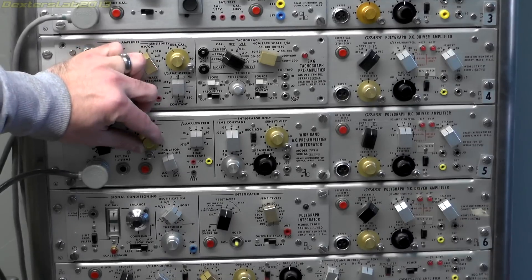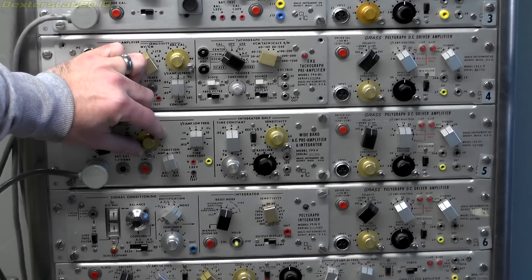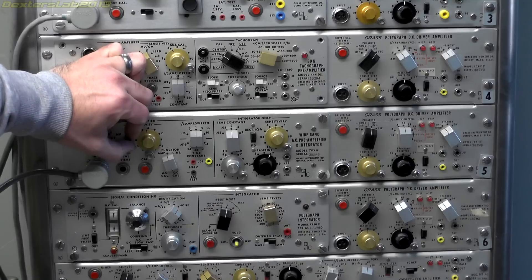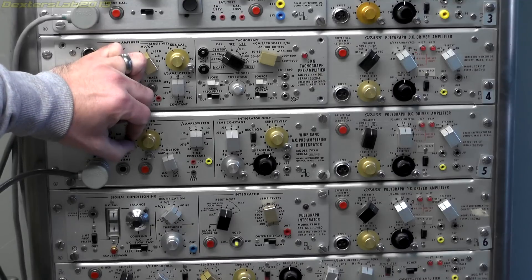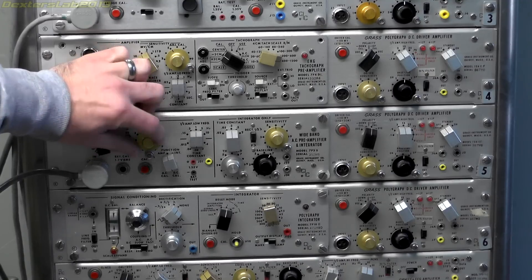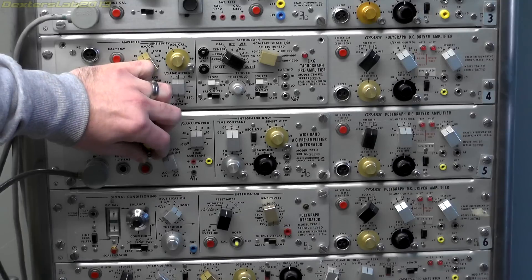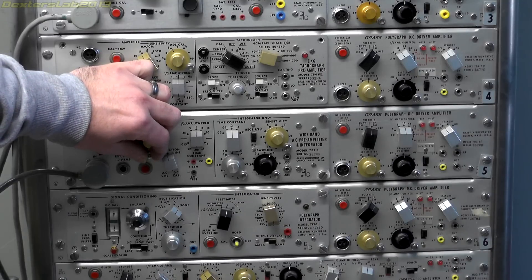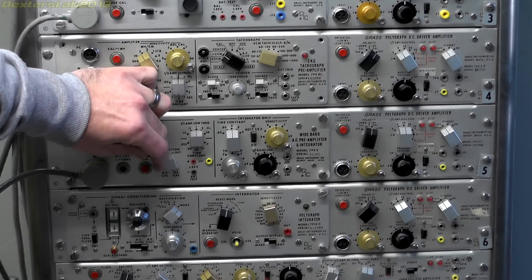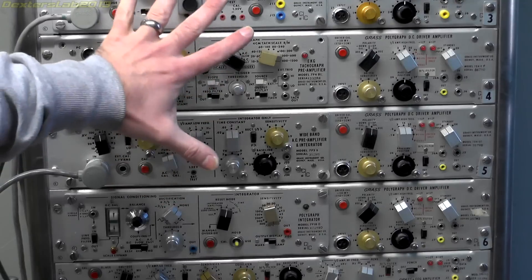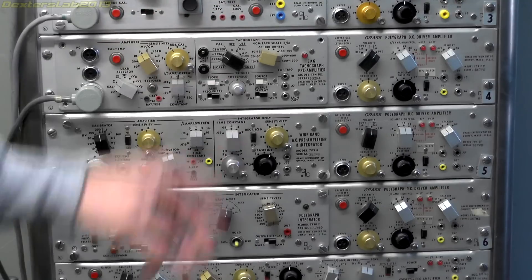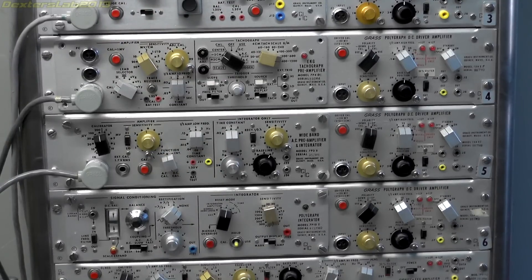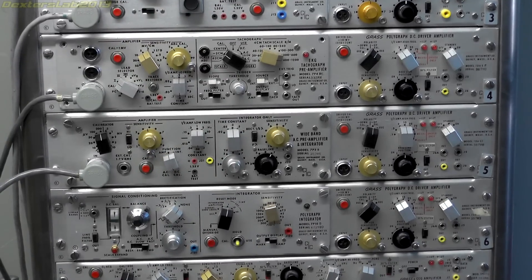I need to run through and check the power supplies because they probably haven't been turned on in a very long time. So those are going to need checking out before I start putting 240 volts into them. But once that's done there's a small possibility this might actually do something. And then I'll have to figure out what I'm going to do with it.